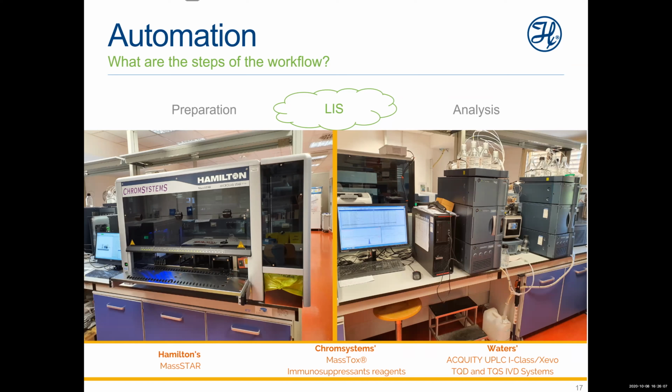But once all the chromatographic information is evaluated, this information can be moved back to the laboratory information system, always using the middleware. In this case, the middleware takes the results, and considering that they are already associated with the barcode of the sample we have received, they can be associated without any chance of error to the correct placement.